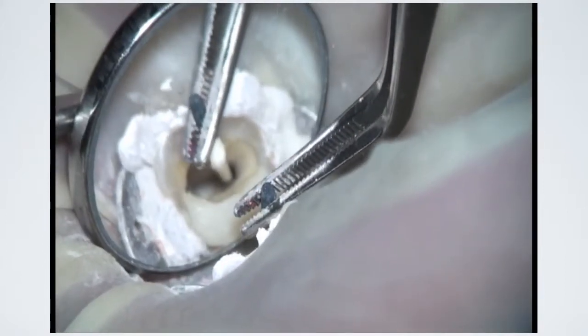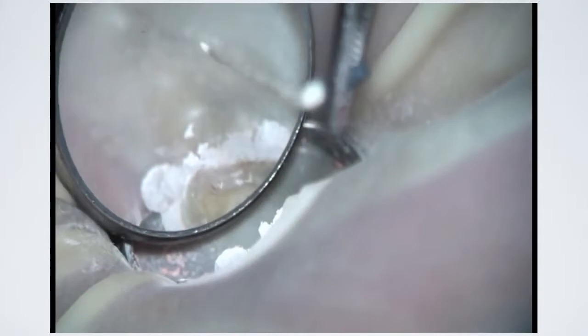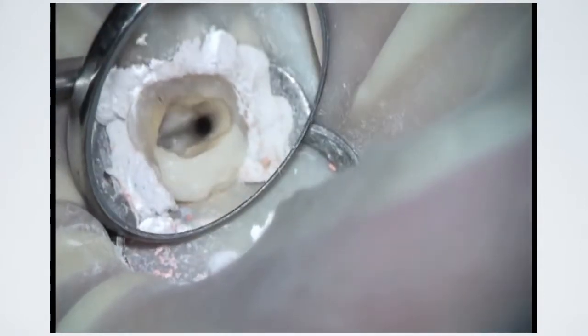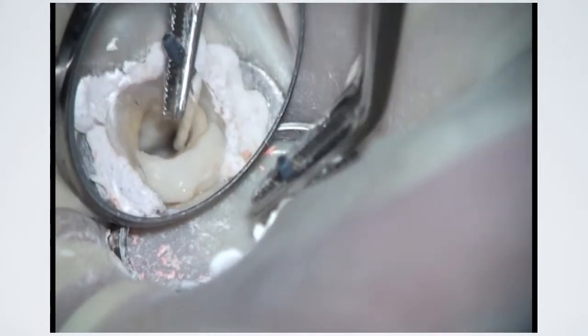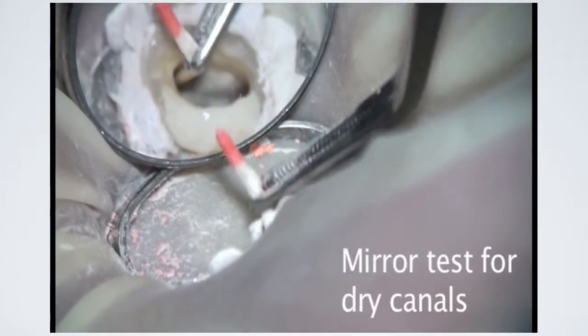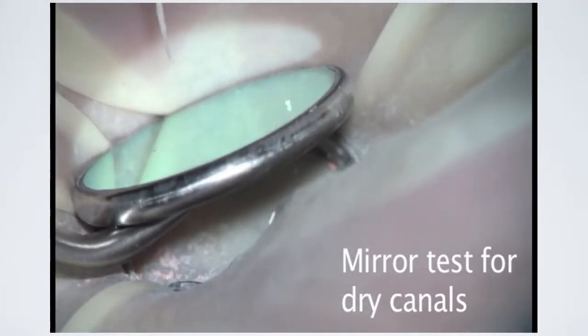0.04 tapered paper points should be used in preparations of 0.06 taper or greater in order to ensure that the paper point will reach the apical extent of the canal without binding coronally. The paper point is removed from the canal and lightly tapped against the mirror.